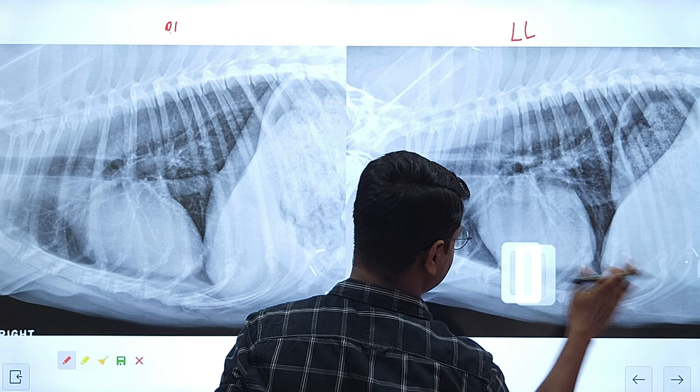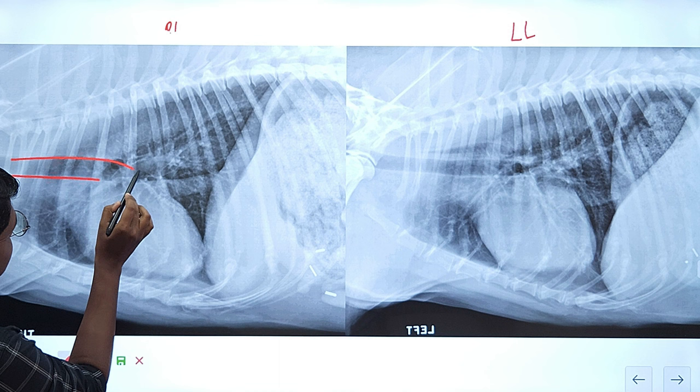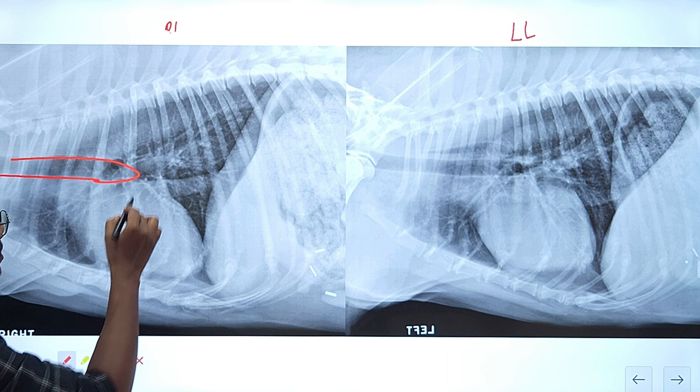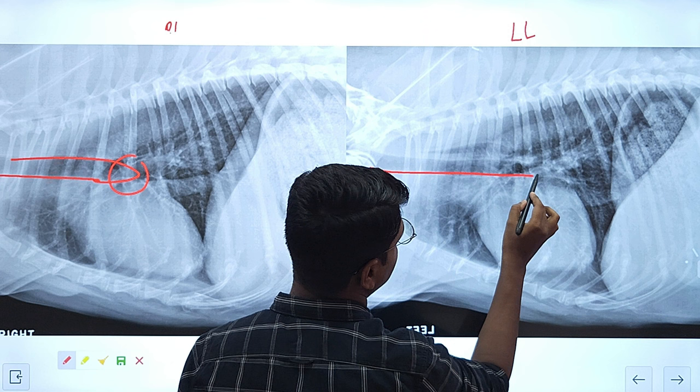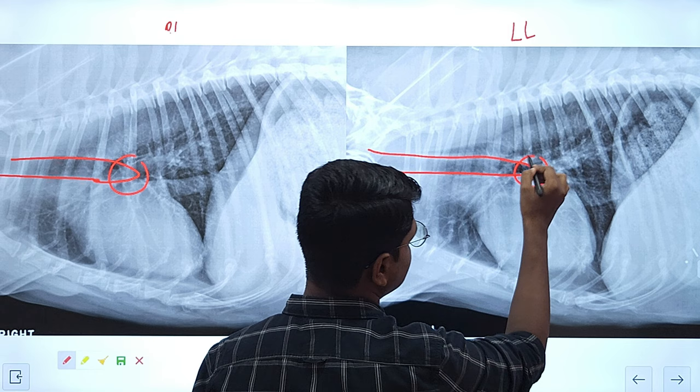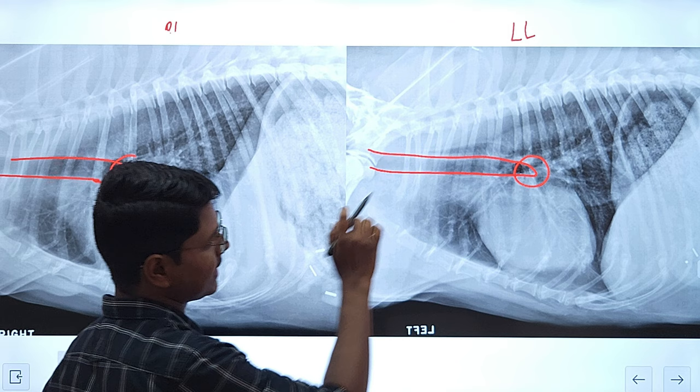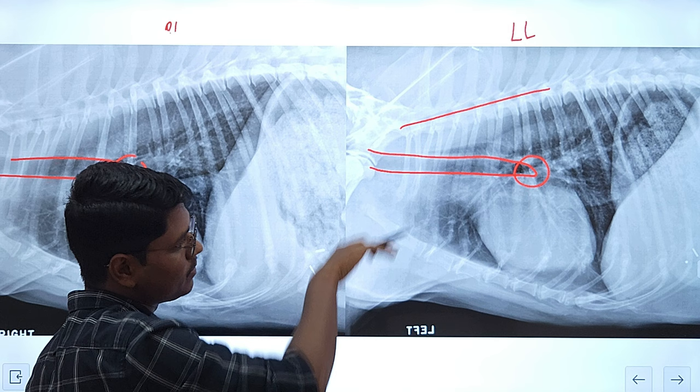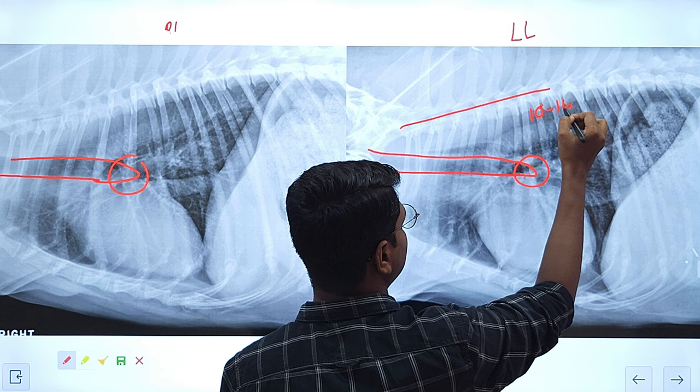Next, we will discuss the trachea. Here you can see the trachea coming down, and here will be the tracheal bifurcation. This region is known as the Carina — C-A-R-I-N-A. One thing to remember: the trachea usually deviates away from the spine. The usual angle is 10 to 15 degrees.